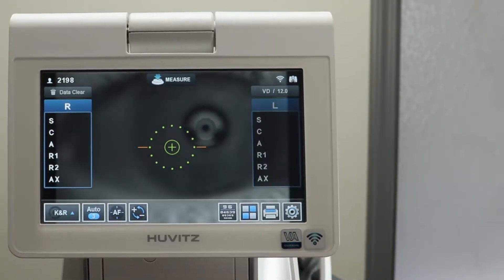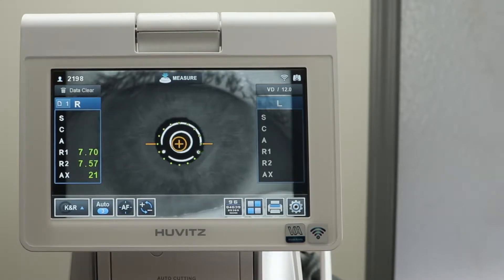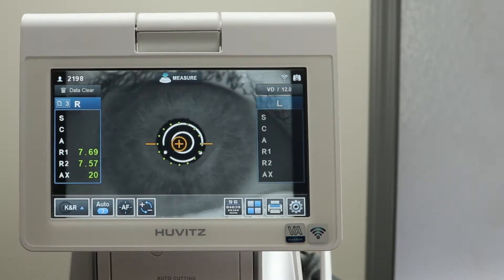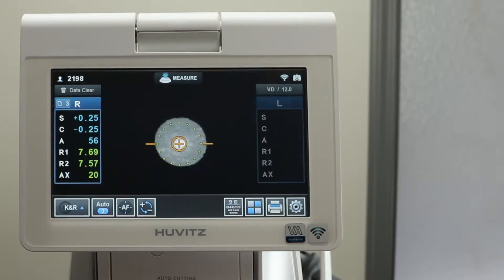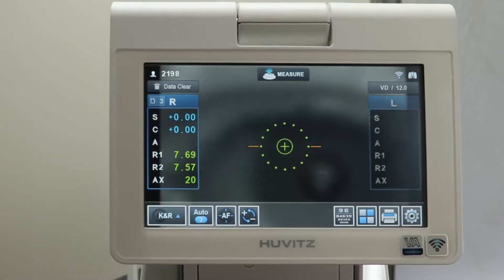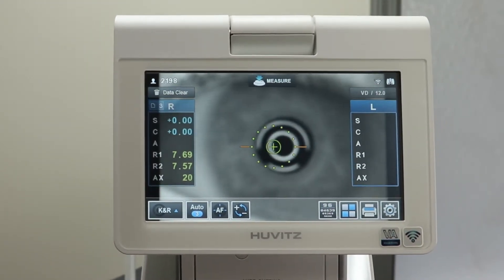Using autofocus and automeasurement mode, refracting a patient is a quick and easy experience. Use the joystick to line up the crosshairs until they are orange. In automeasurement mode, the refraction happens as soon as it's lined up.